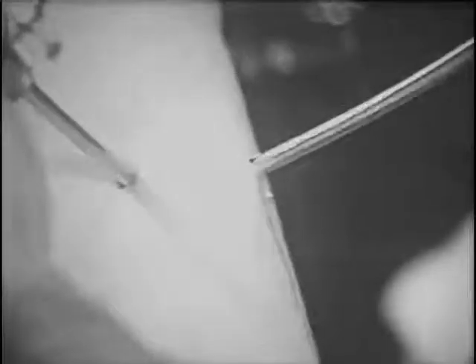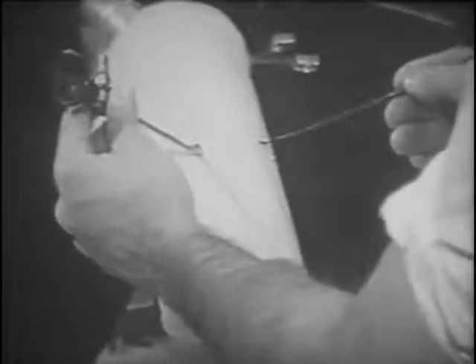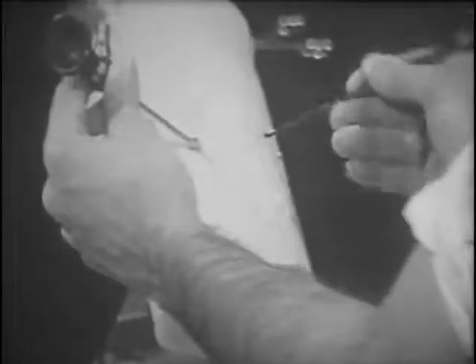Occasionally only a small fragment is left. A free piece of meniscus is now visible within the joint, attached to the Johnson jaws. This is slowly removed and taken out percutaneously through the lateral side. The operating arthroscope is then replaced by the diagnostic scope.